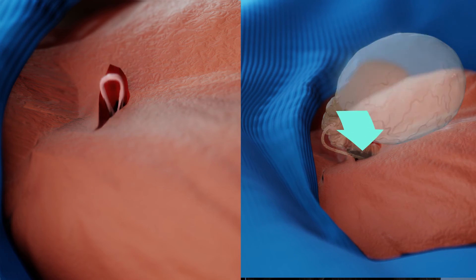Once the procedures are completed, the newly connected regions are returned into the body and the wound is closed. A sterile bandage is applied and the surgery is completed.